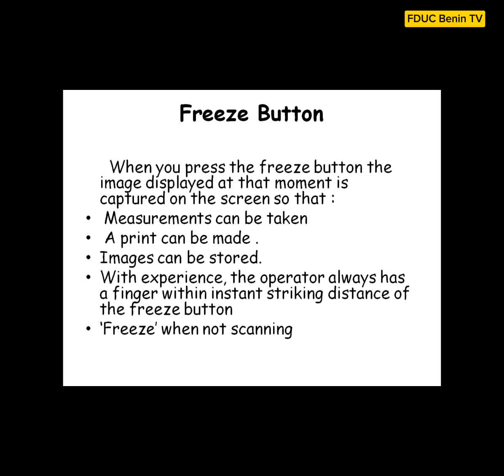But not to worry, as we get more proficient and improve, we will not be too worried about freezing every minute. Again, to keep your machine, it's good to freeze the machine when you are not scanning.